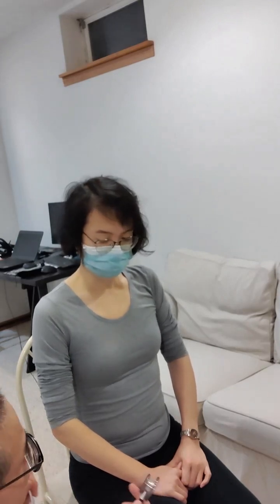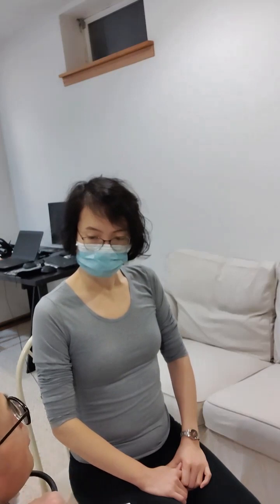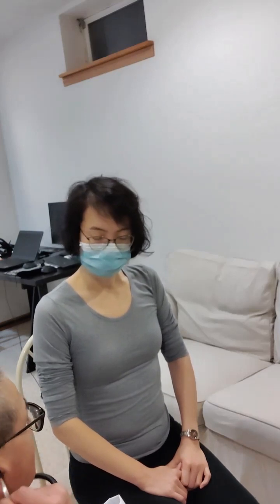So next, I'm going to use the bell of the stethoscope to listen for murmurs.